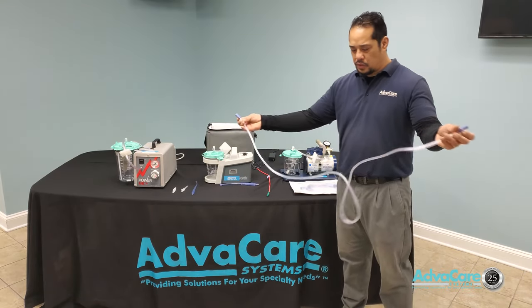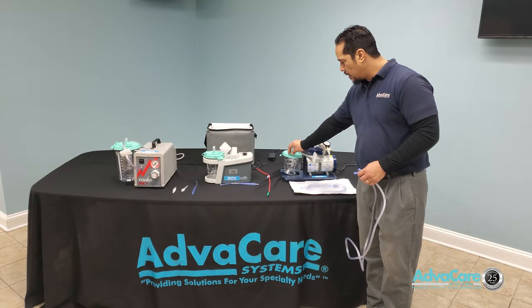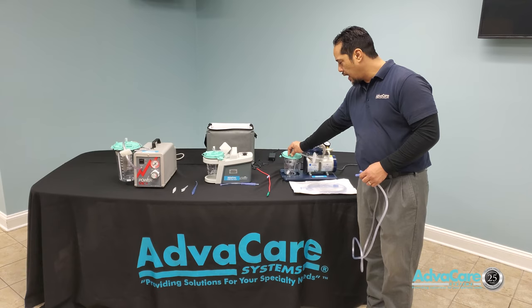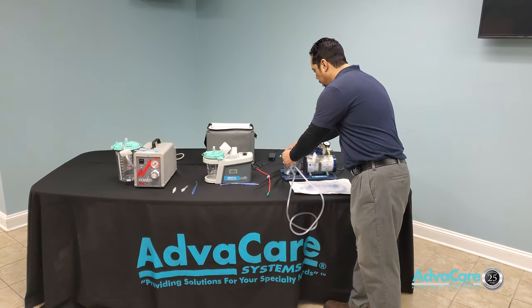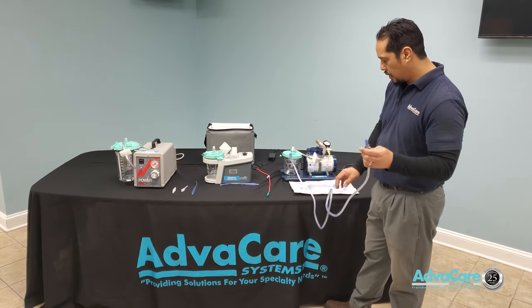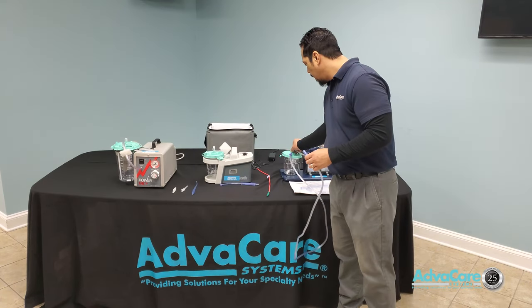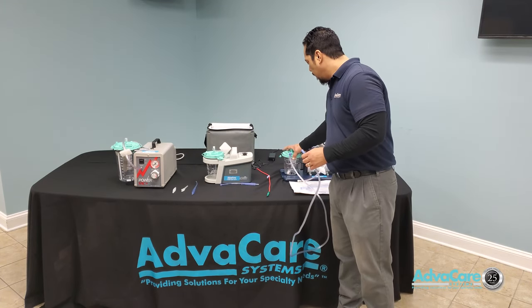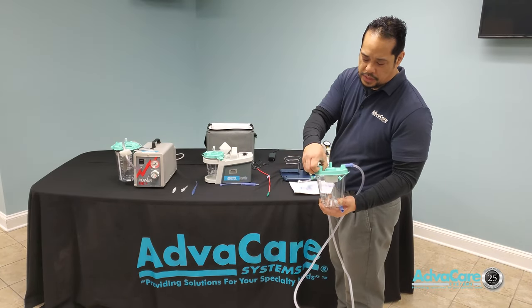When it comes to the tubing, you have two female connectors. One side will connect to the front port on the canister cap and the other side will connect to the Yankauer with ball tip or catheter. There is also a larger port on the back side of the canister cap that is for emptying and drainage, so you do not have to remove the whole canister lid when attempting to drain fluid.